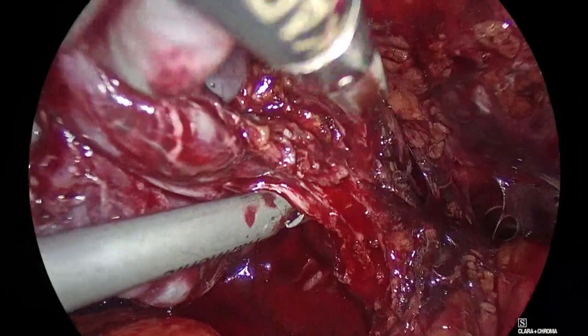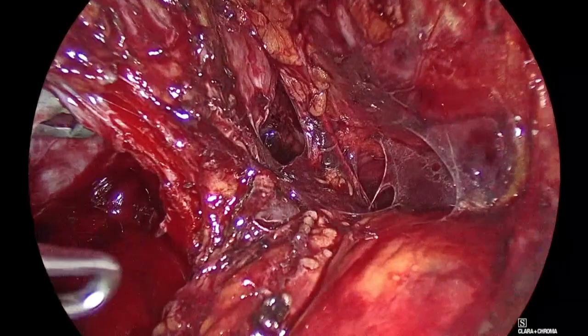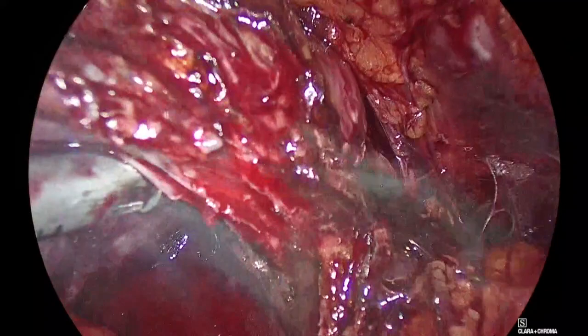Panagiotis to me. Given the bipolar, I see a vessel there. You see the vessel here? Now you could suture it. But I don't want to risk, bipolar. No, clip. Yes, scissors and clip, please. Go back, Padeli. Go back.